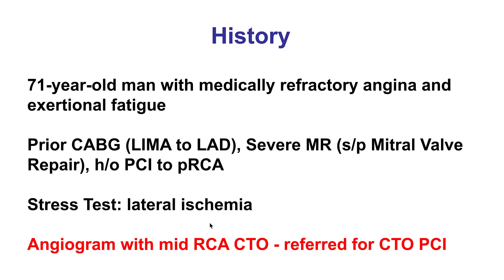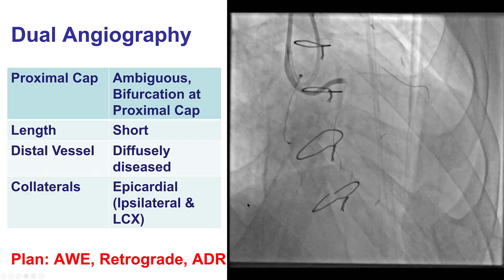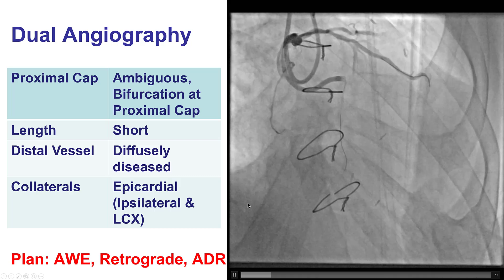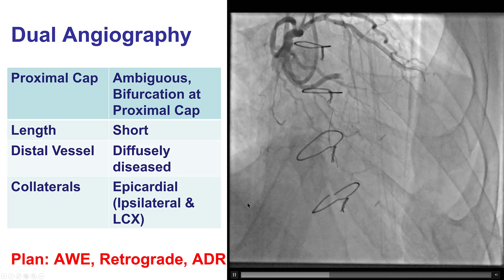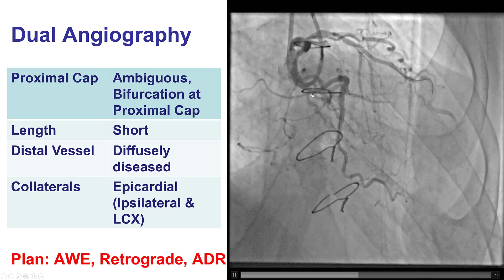The patient presented with medically refractory angina. He did have previous coronary bypass with LIMA to LAD as well as mitral valve repair, and he was found to have a right coronary artery CTO that was considered to be the culprit lesion for his symptoms. He was referred for PCI of the right coronary artery CTO, and this is the dual injection.